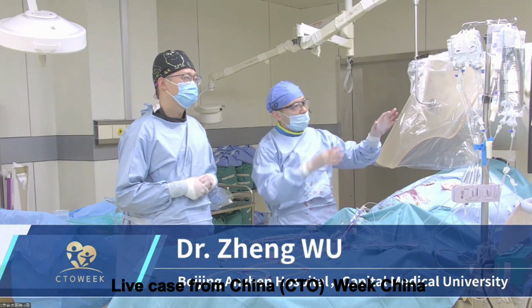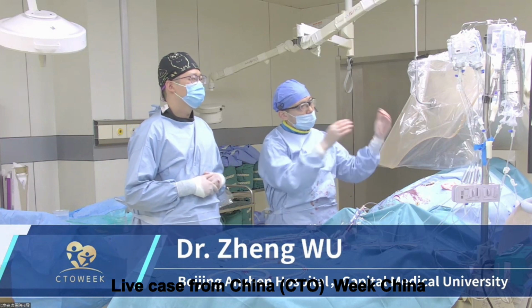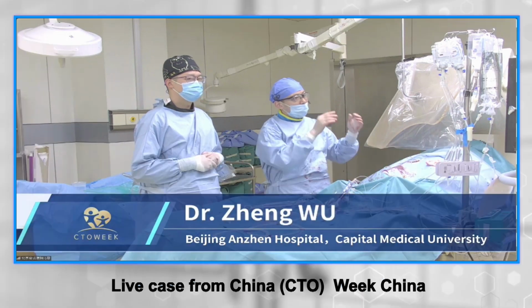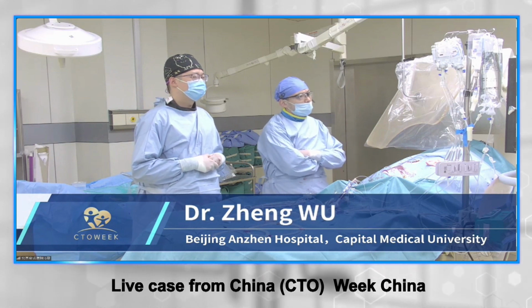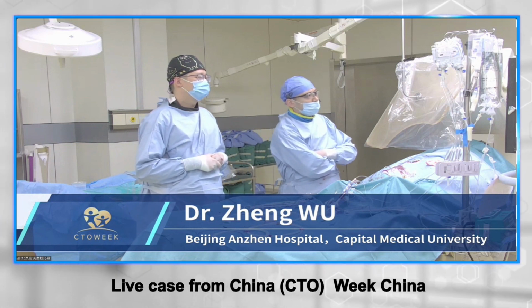And you know that from the proximal to the distal LAD, of course there will be some bending in this segment. So I think it is at least a JCTO score of three for this patient.